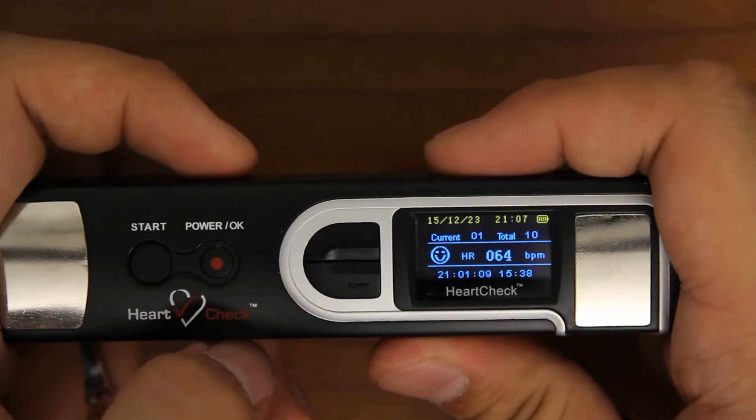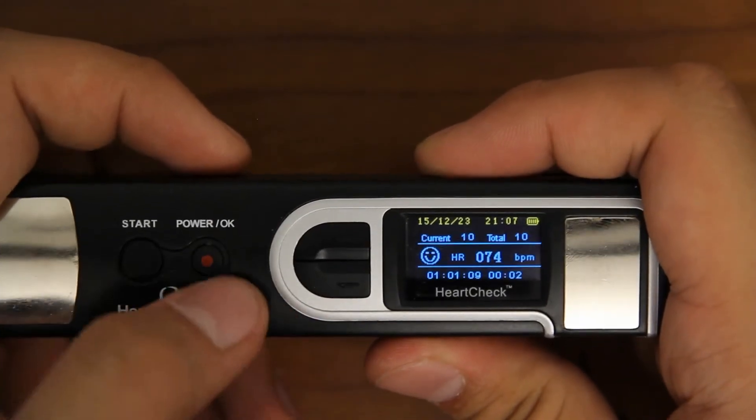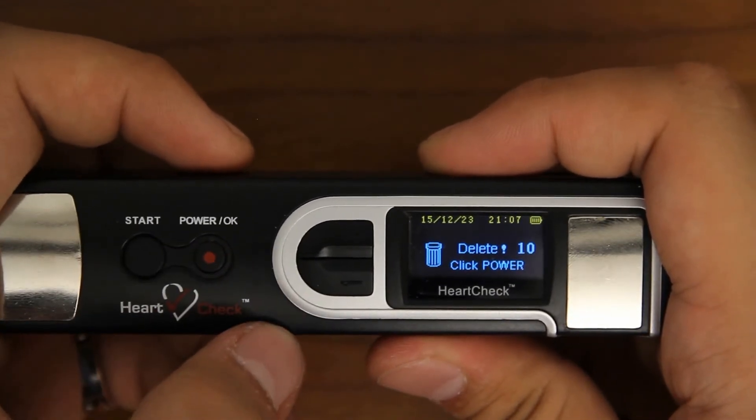Once in the Delete Data category, you can scroll through the ECGs stored on your device. To delete the ECG, press the OK button, then press it again to confirm and delete the selected ECG file.